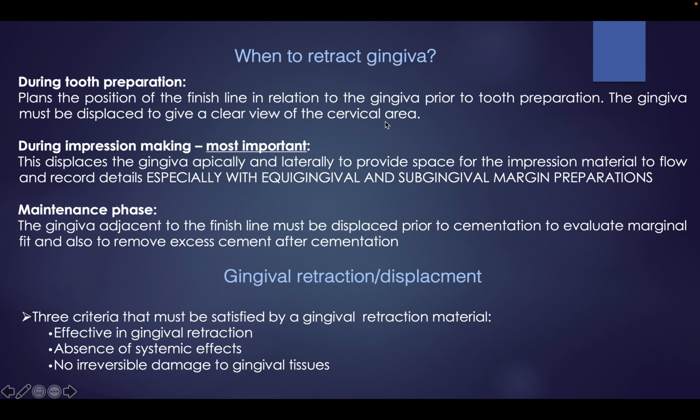So again, when do we retract the gingiva? We said it's very important to retract the gingiva because you need to capture the margin and to capture beyond the margin and to be able to have a better reading and evaluation of your impression.